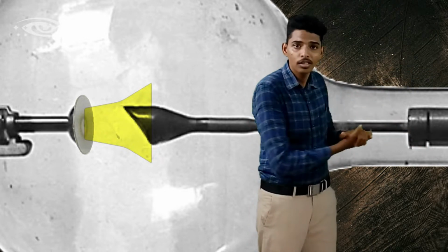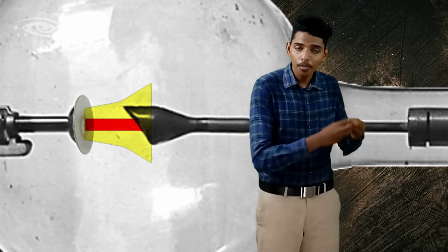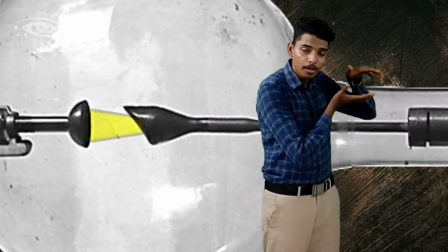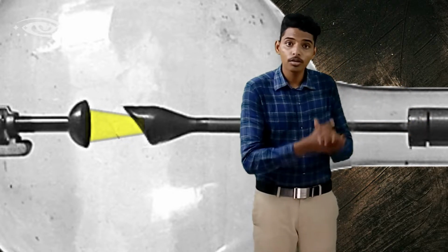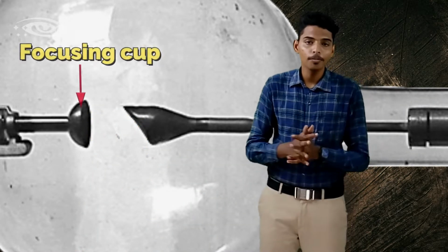Because of this divergence, only some of the electrons are going to interact with the anode and produce fewer X-rays. If we focus the electron beam, all the electrons are going to interact with the target and produce more X-rays. For this reason, the focusing cup is used inside the X-ray tube. Now we'll see about the construction of the anode.